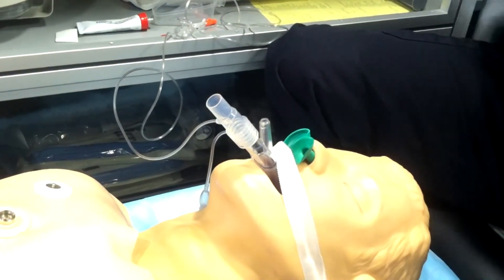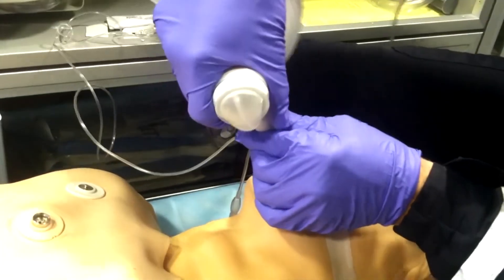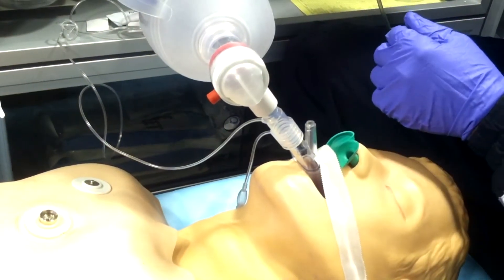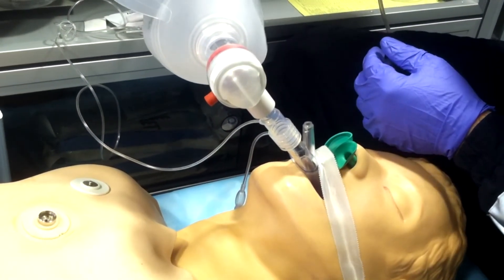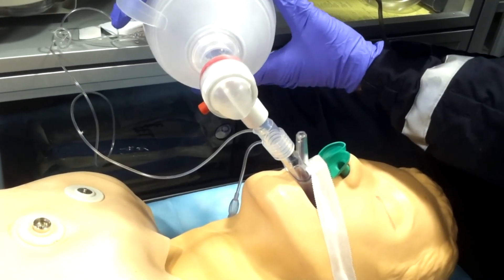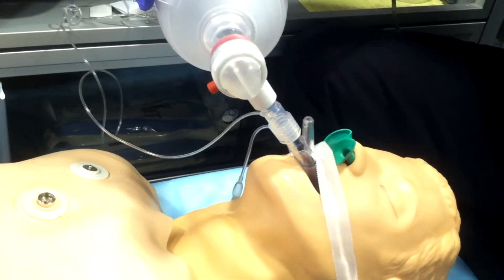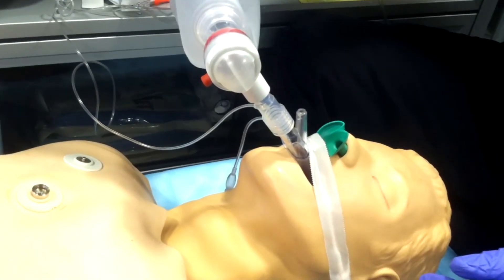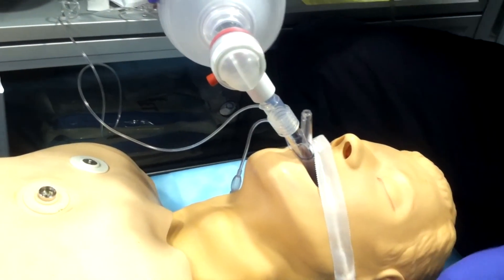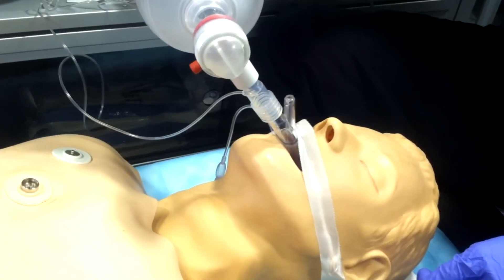Next is fixation — tape it down either after or prior to confirming correct placement. Then ventilate: when you put the BVM on, check for ET CO2 and equal bilateral chest rise. Confirm ET CO2 and that the airway is placed correctly. The NPAs are still in but you can easily remove them — they're not going to help but they won't damage anything either.